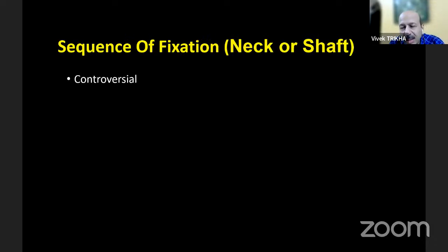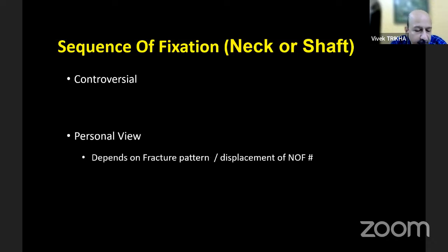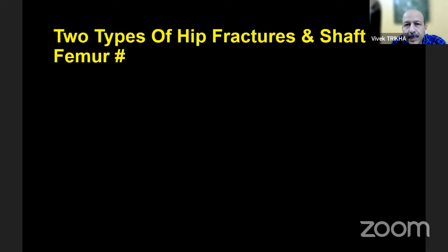Now coming to the sequence of fixation: the neck or the intertrochanteric region first, or the shaft first. It is controversial. It totally depends on many surgeons' preferences and choices. What I'm going to show you is our preference in our hospital, which we have also published, and it depends on the fracture pattern and displacement of the neck femur or the IT fracture.